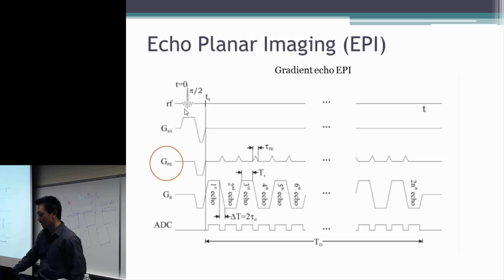So you remember in chapter 16 when we talked about the RF pulse, if we apply the sinc pulse, it is assumed that the major effect takes place at the center of the RF pulse. So that means half of this slice select gradient has a dephasing effect on the excited spins. So we need to use negative gradients to compensate for this dephasing effect. Okay, so how about this one?